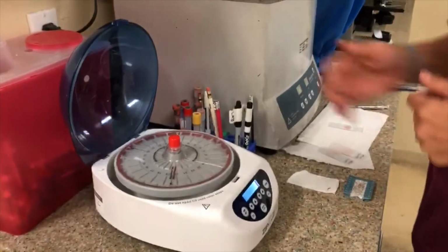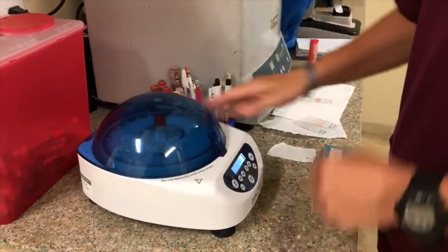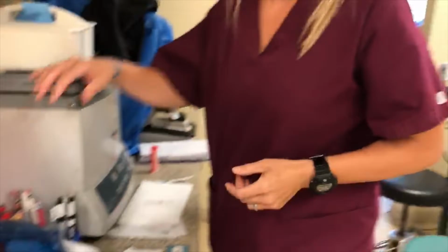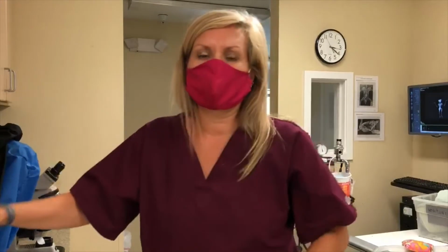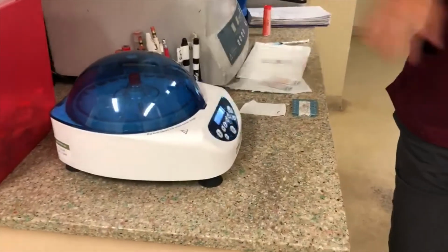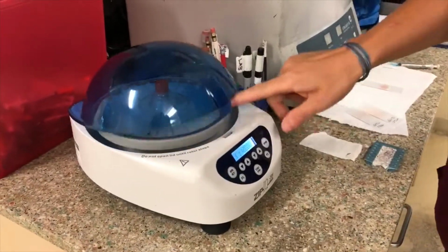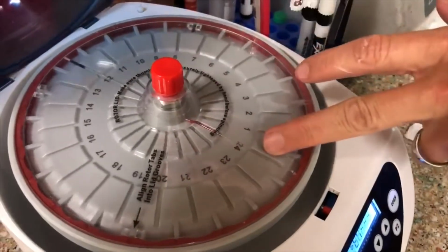Hey Missy, when we're doing packed cell volume and total protein, what types of information can that give us about the animal in terms of treatment? So it can tell us if the animal's anemic, dehydrated, if the animal's had starvation, if they've had blood loss in another way, where they might need to get an IV catheter placed where the vet can tell us exactly what fluids specifically the animal needs. So this little tiny hematocrit can give us that much information right off the bat. That's amazing. So we're going to spin it down. You can see it in there, the two different. This one's been spun down. I'm using it as a balancer.